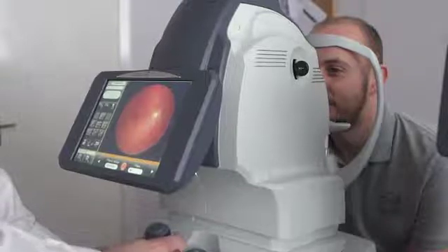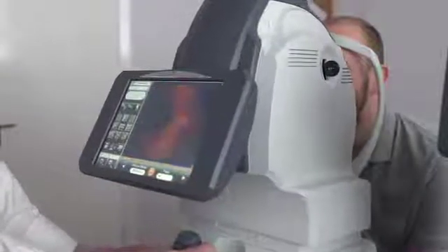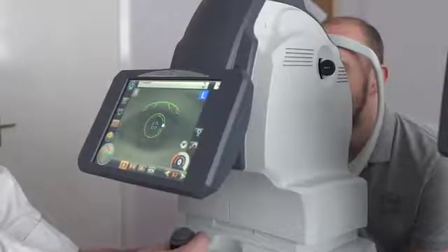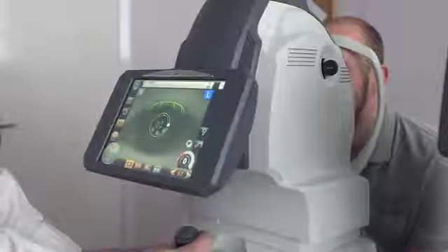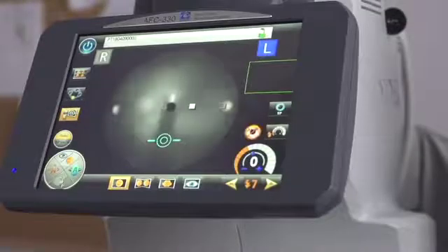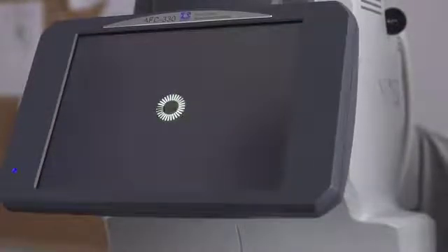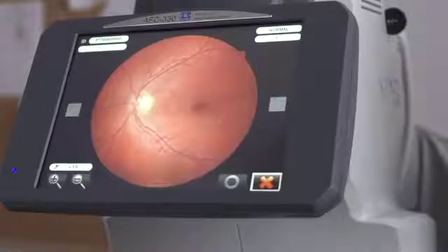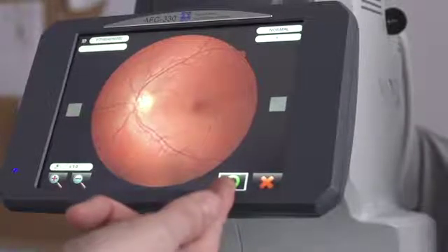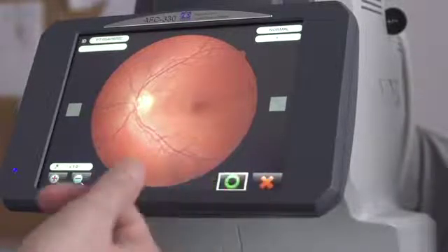To take the shot of the left eye, we simply move across to the left hand side. Position the device in front of the patient's pupil and move forward to alignment. Once again, the AFC will take over and take the photo. And once again, if you are happy with the photo you press the green circle. If you wish to repeat, press the red cross.